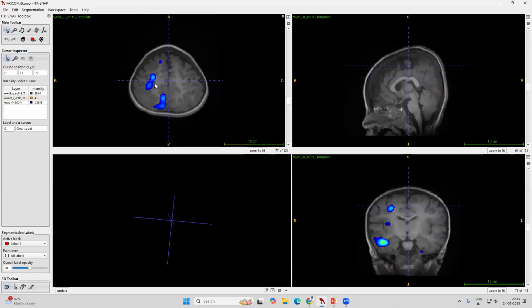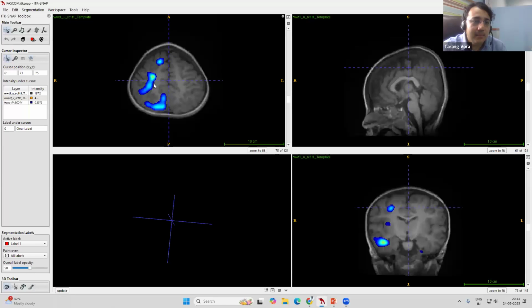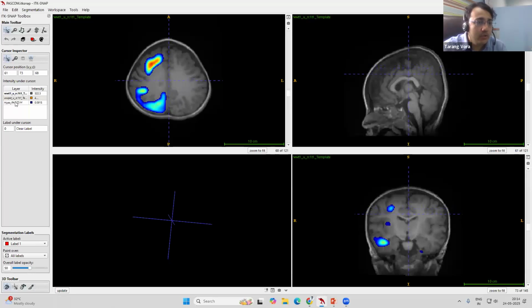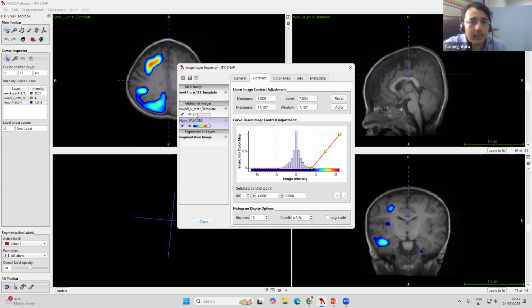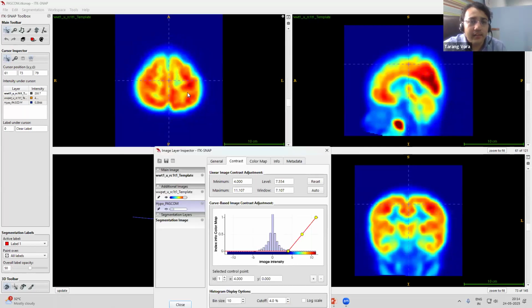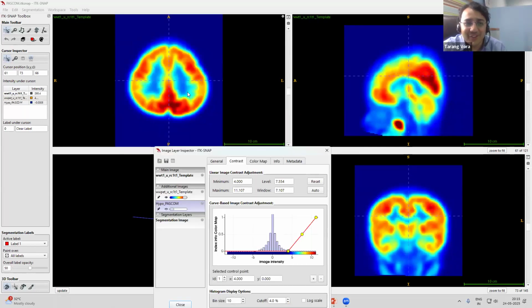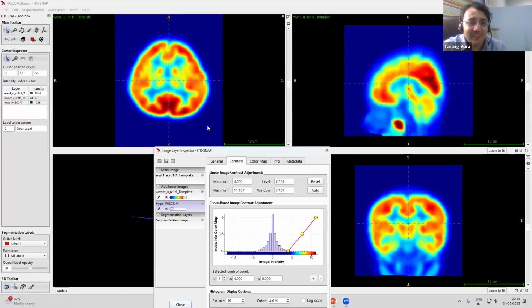So this is PASCOM, what I was talking about, developed by Amrita Cochin, and this is the PET. First I'll show you how it looks. This is the normal PET scan that we get, and it's difficult for us to identify which area we are going to resect based on the PET scan.